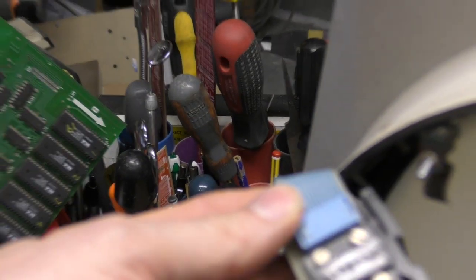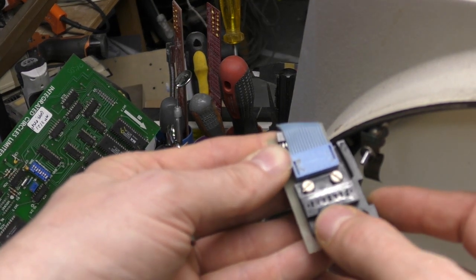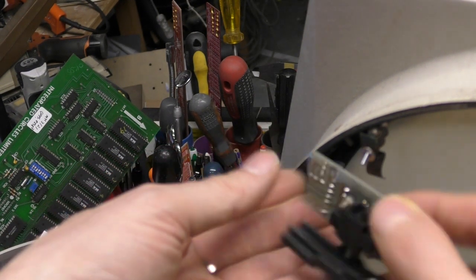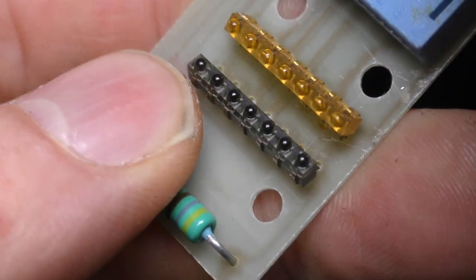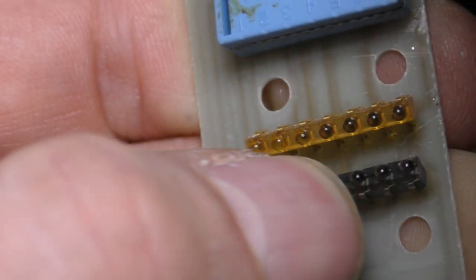And the actual optical sensor here, I suspect, might originally be designed for a paper tape reader. The size looks about right for it. This plastic cover with some small holes, and the actual sensors, I'd imagine these are probably infrared LEDs and most likely phototransistors, set at an angle to get a nice clean reflection off those metallized sections. But this looks like it's a single unit.